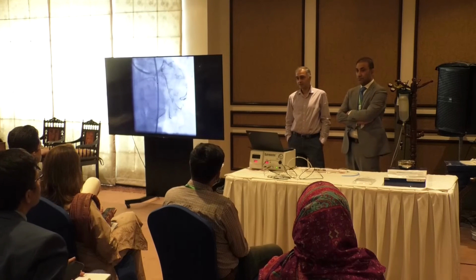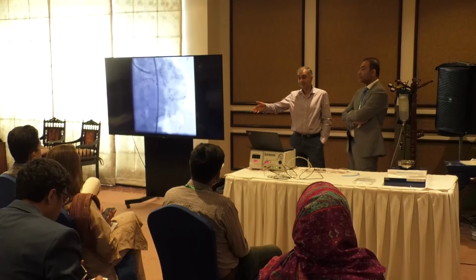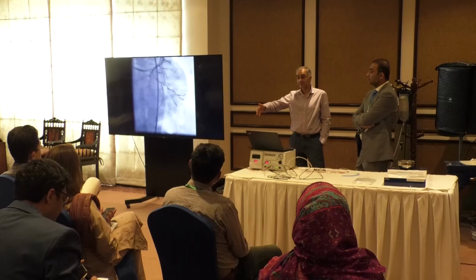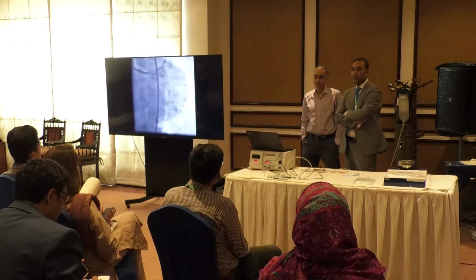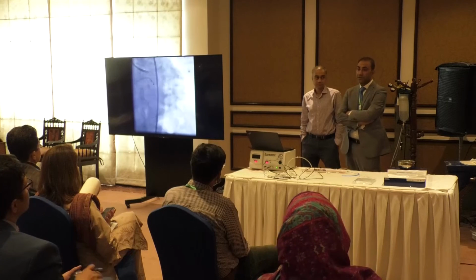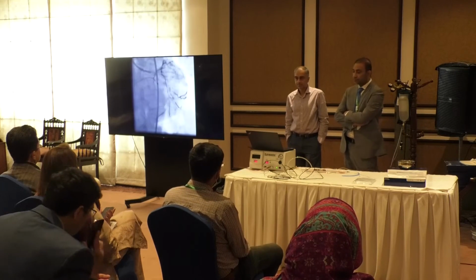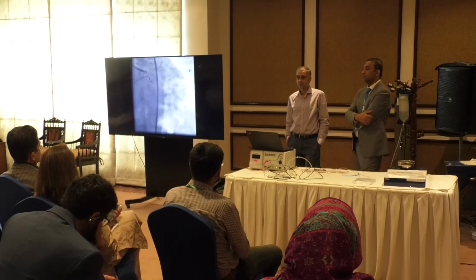You need a second guiding catheter. You have your workhorse wire in the circumflex. Let's say you want to rotablate the LAD, you put a microcatheter over it, and you can rotablate the LAD and still protect the circumflex at the same time. Yes, in a situation when there is critical circumflex disease, or a dominant circumflex, again, the concept of differential cutting. If you put a wire, that will definitely be cut by the rotor. If you put a microcatheter, there's some reduced risk. If you want to read about that technique, we published this last year, I think, in a journal.